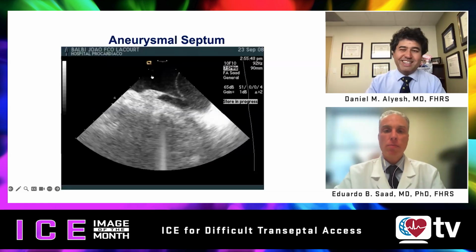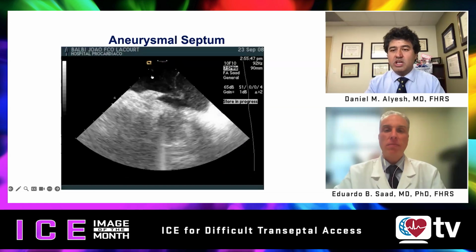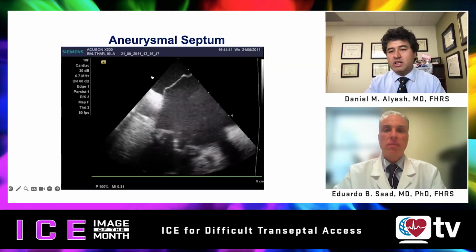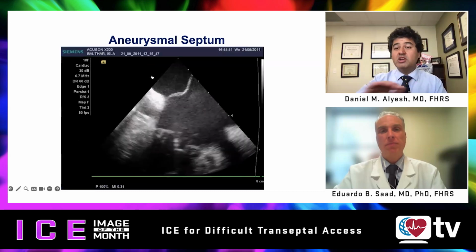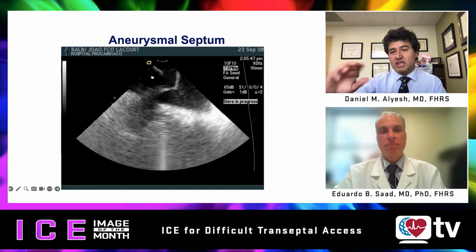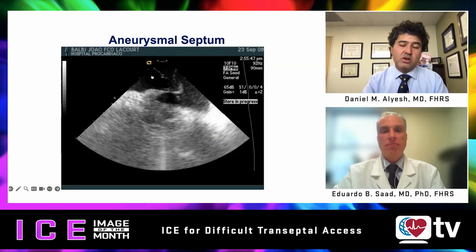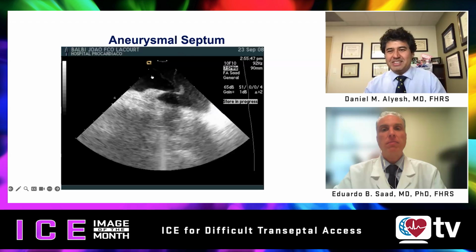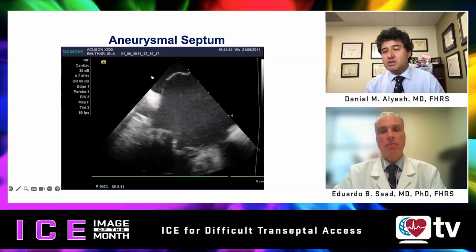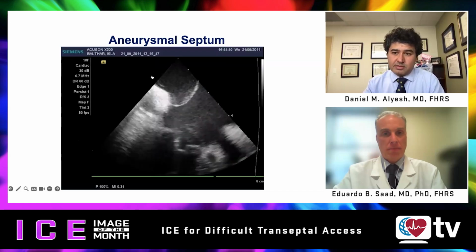The other point I'll make is the SafeStep wire. What I often use in this situation is you tent to a degree, then you put your SafeStep wire through. It immediately punctures, and then it immediately J's as well. You can put it into one of the veins and rail over it as well. But you need to have a strategy, because just using the needle is actually, I think, where you can get into trouble.